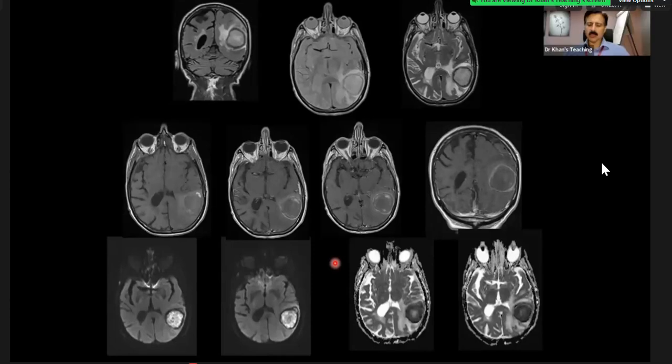Sorry. So what is your conclusion? Is it a tumor? I changed mine. Yeah. So you were right first. Initially you were right. And please remember that this has been asked in the exam so many times. Where is the restriction?